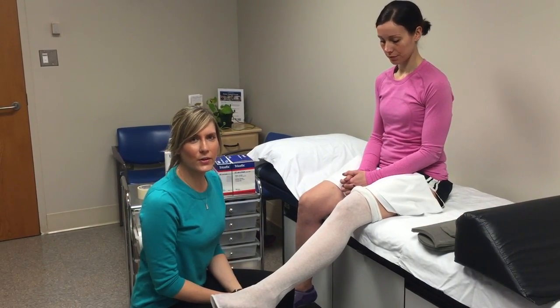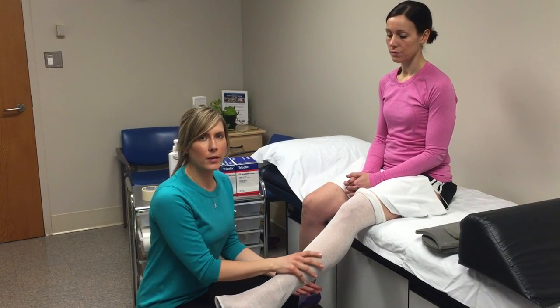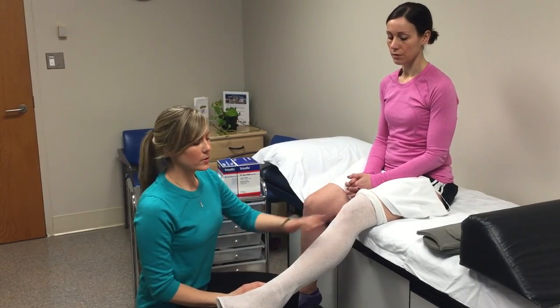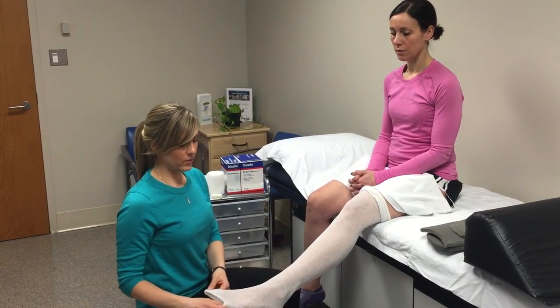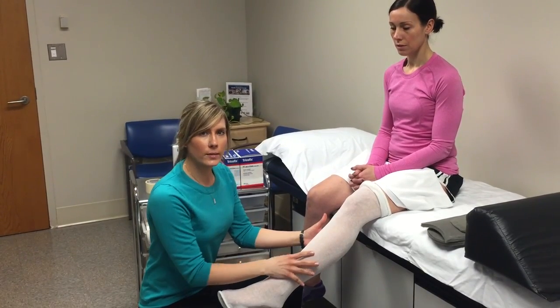Hello, the purpose of this video is to explain how you would help wrap a leg that's affected with lymphedema up into the knee. Before you would start, you would apply a good amount of lotion to the entire part of the leg that will be wrapped, and then you would fit the leg with a stockinette. This is just to protect the skin.